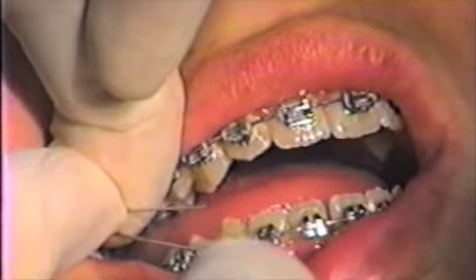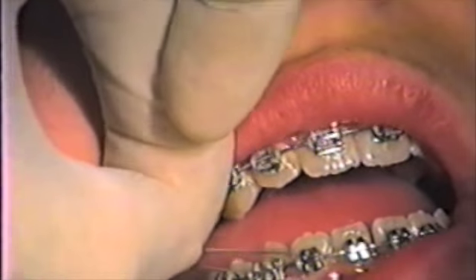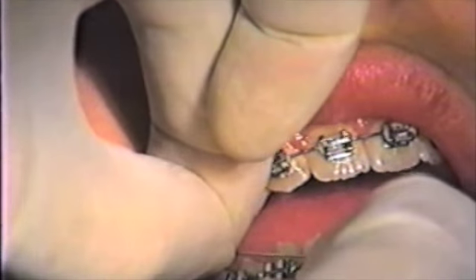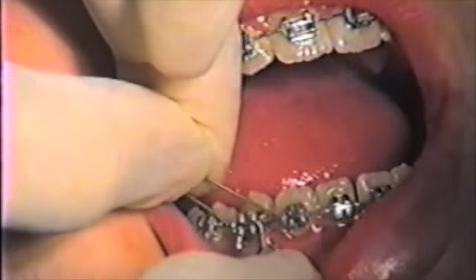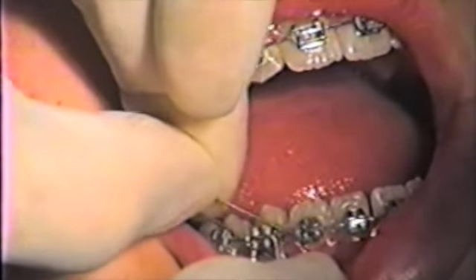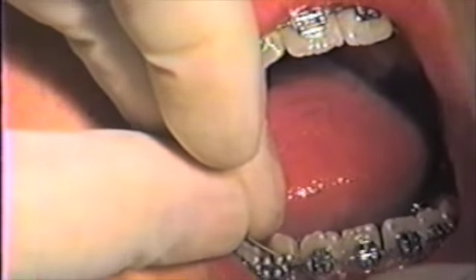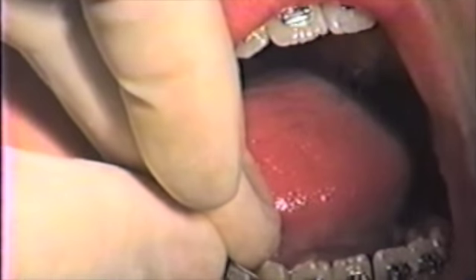The wire will now be threaded into the connector underneath the bracket and the wire, and ligated around the loop — or in some cases, just around the cuspid bracket — depending on the mechanics you would like to use on that particular case.